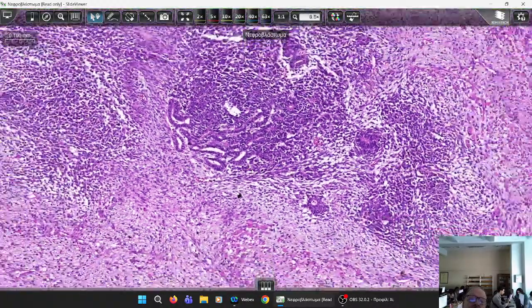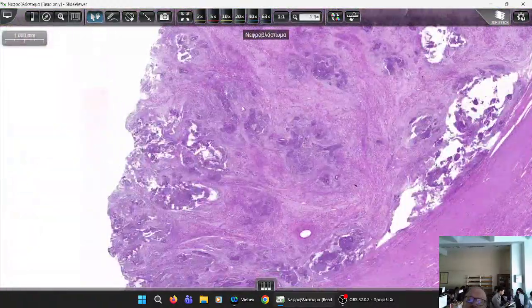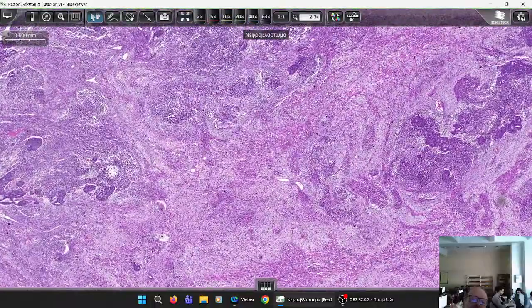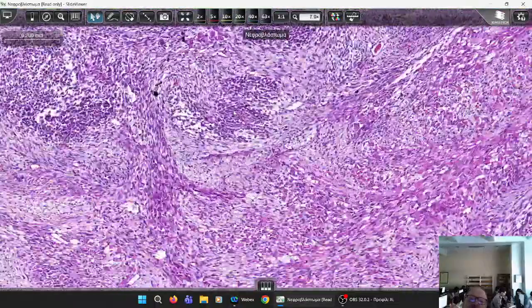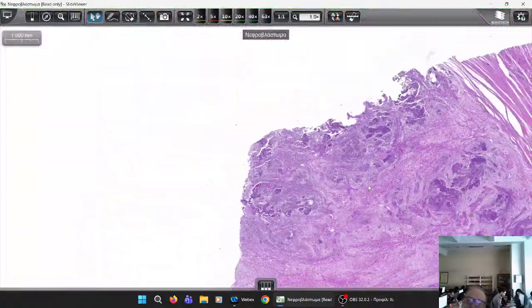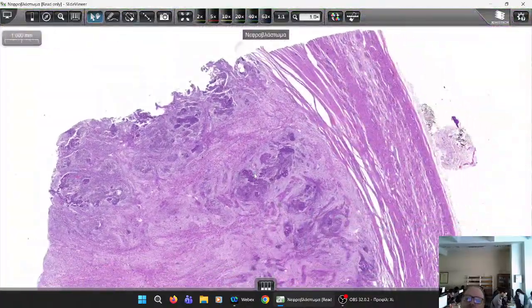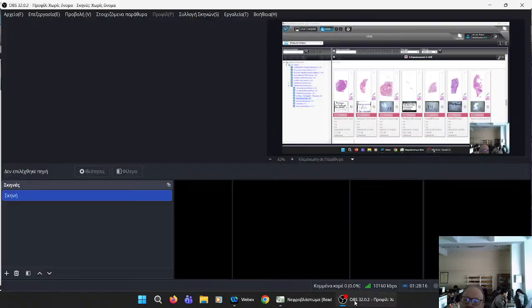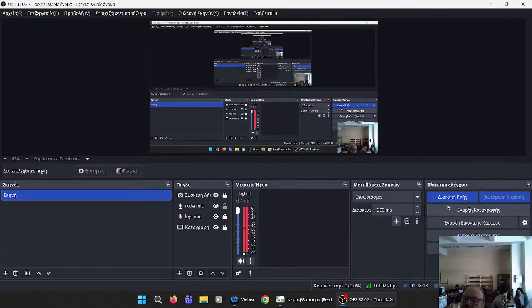Here, the epithelial component of the Wilms tumor, which expresses the respective immunomarker, WT. Wilms tumor. That was the case of the nephroblastoma. So I think we've finished all our slides, and that's the end of our laboratory exercise on urinary pathology. Thank you.